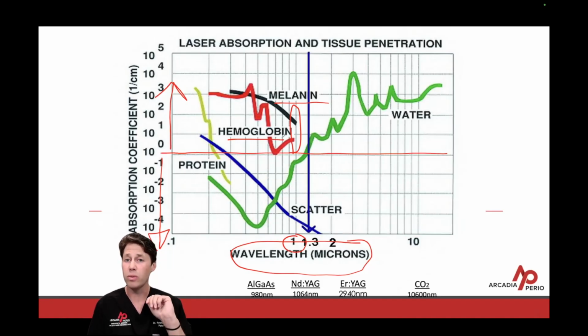So now you know why the laser selectively removes the pathogenic bacteria, but it leaves behind all of the healthy tissue. Super important. What does that mean for our patients? It means you're going to heal super quick, right? My scalpel blade cannot differentiate between infected and inflamed tissue and healthy tissue. When you cut, you remove excess tissue. So there's no longer any cutting with this laser, right? It's selective removal of all of the bad stuff. It's awesome.